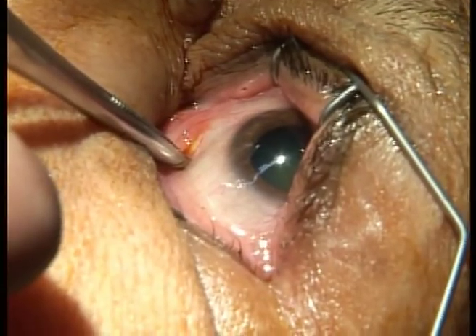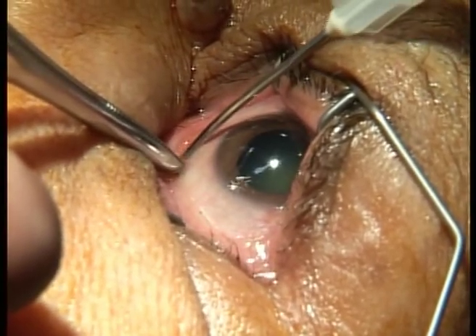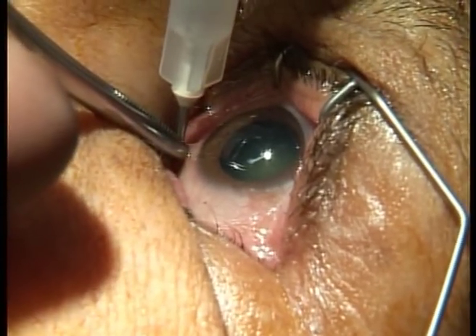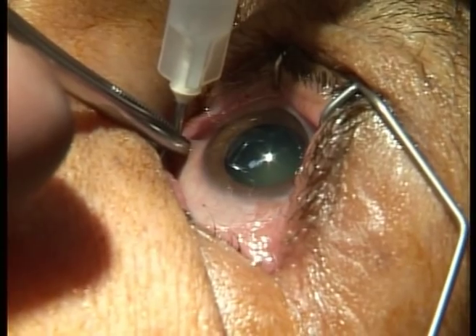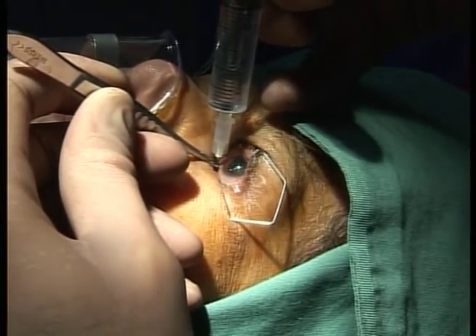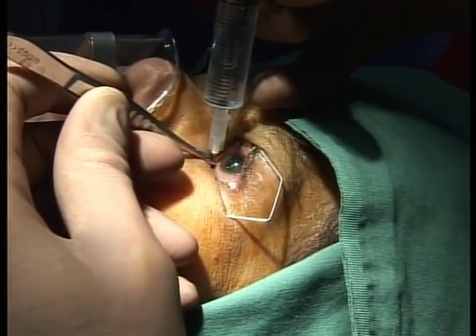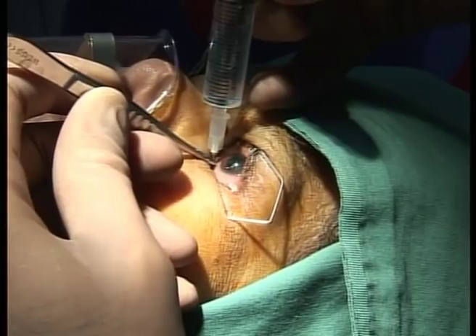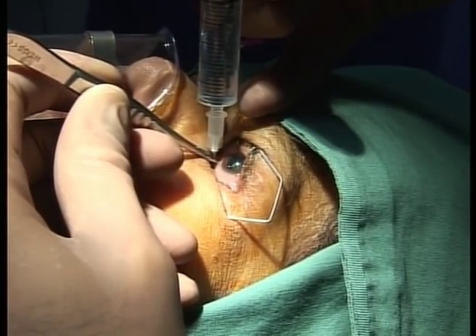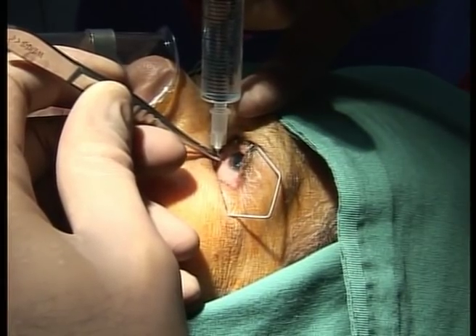I then again rest my hand with the syringe against the patient, and now I have both hands resting on the patient and the shaft of the needle resting against the forceps. So there's no tremor, everything's quite stable, and I start to inject. On this occasion I've got a little bit of resistance to injection, so what you do there is open up the potential space posteriorly by coming up vertical, push against the globe and lift, as if you're trying to lift the globe towards the ceiling.